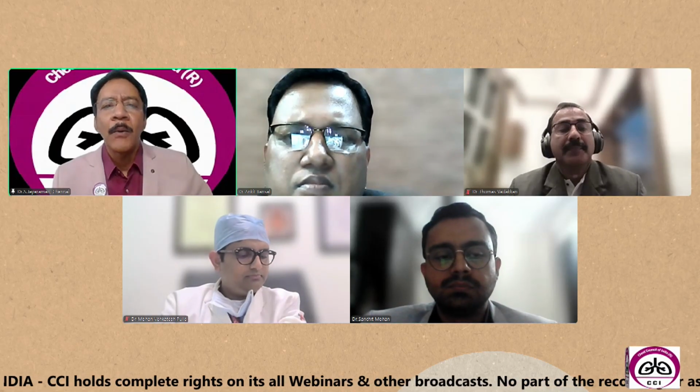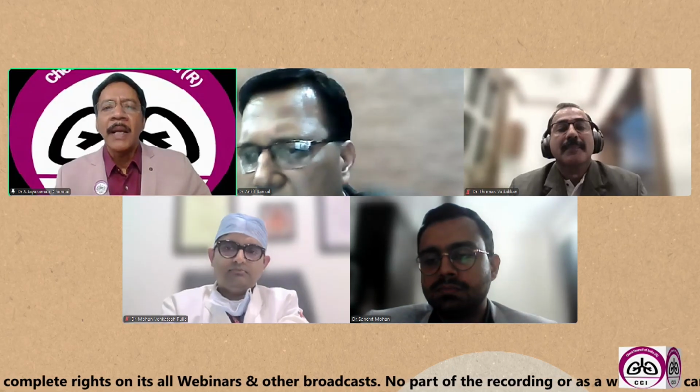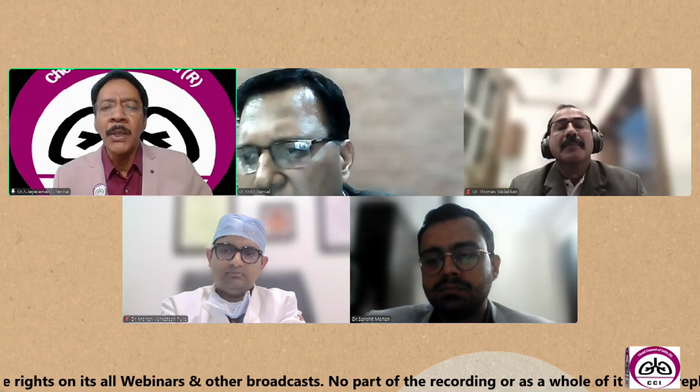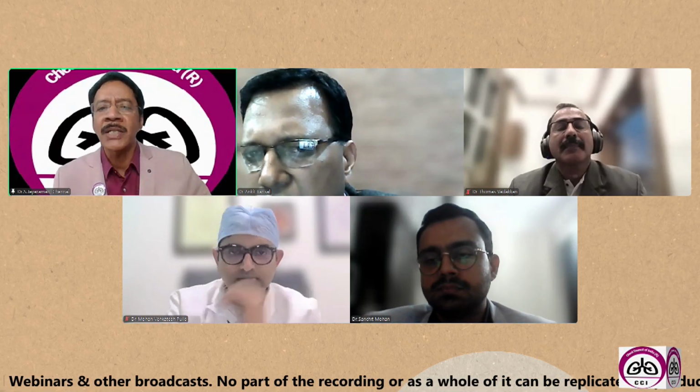One more question from Dr. Darshan Kumar Bajaj from Lucknow, Uttar Pradesh. I think even with combining EBUS and EUS, we will not be able to sample station 6 also.